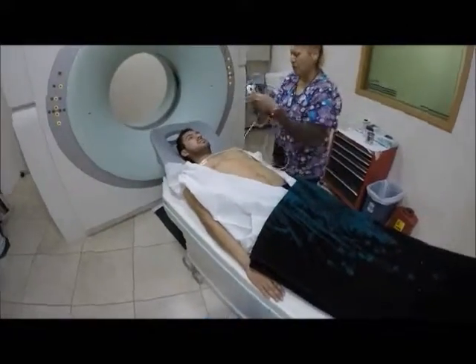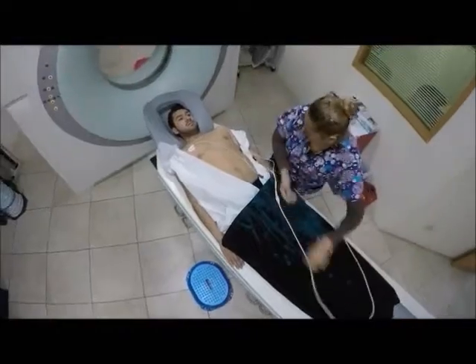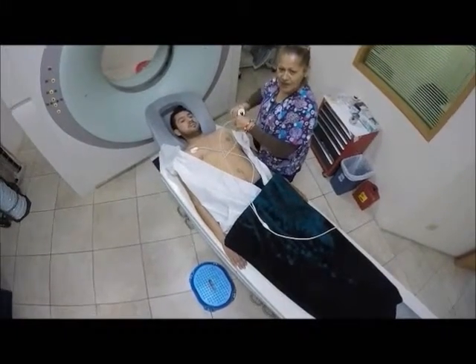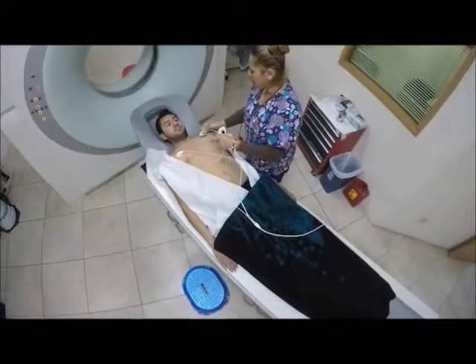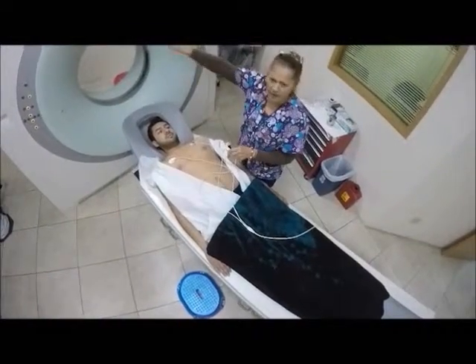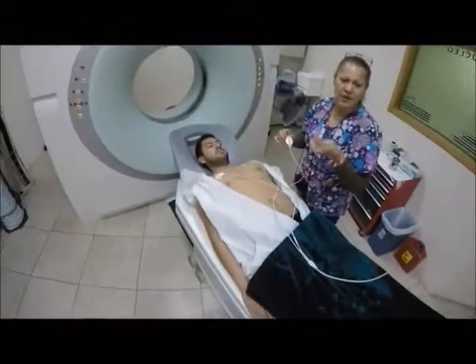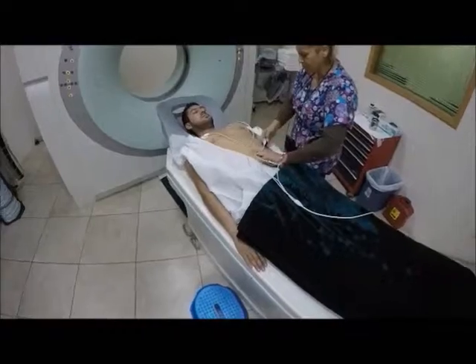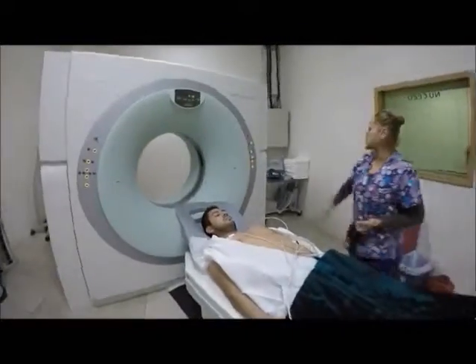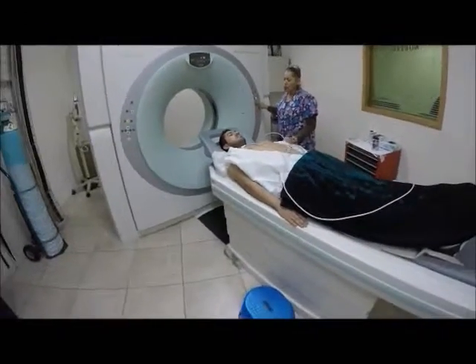When contrast material is introduced to the bloodstream during the procedure, it clearly defines the blood vessels being examined by making them appear bright white. The electrodes are attached to an electrocardiograph monitor which shows your heart's electrical activity during the test.